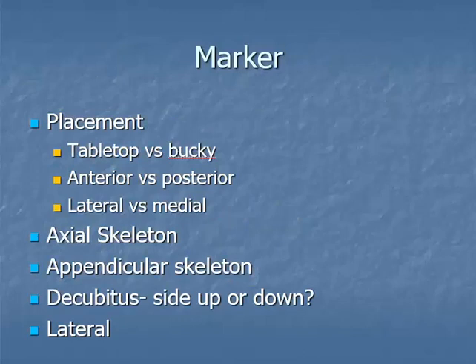So marker placement, my personal opinion is make sure it's on the image, out of the anatomy, and the image is properly marked. Left side represents left side, left anatomy is represented by the left marker, and so forth. Some of your hospitals are very particular, and you just got to follow the departmental protocol. The Bucky's have gotten so thin now that they will eat your marker at the drop of a hat, so I understand people putting the marker on the tabletop.